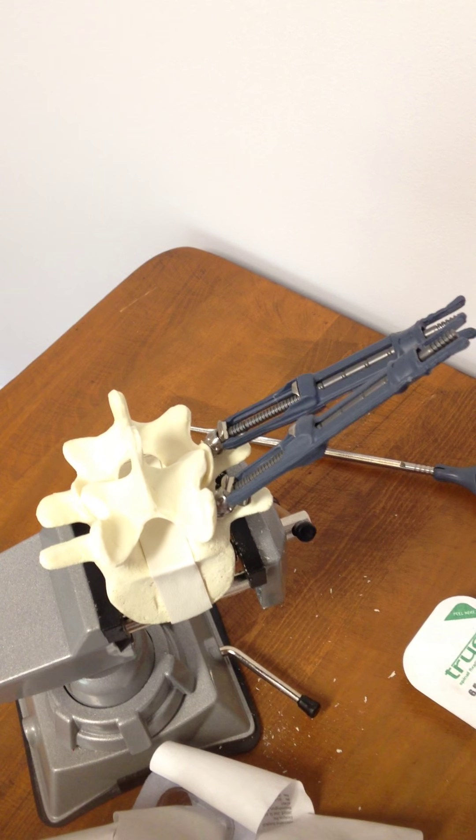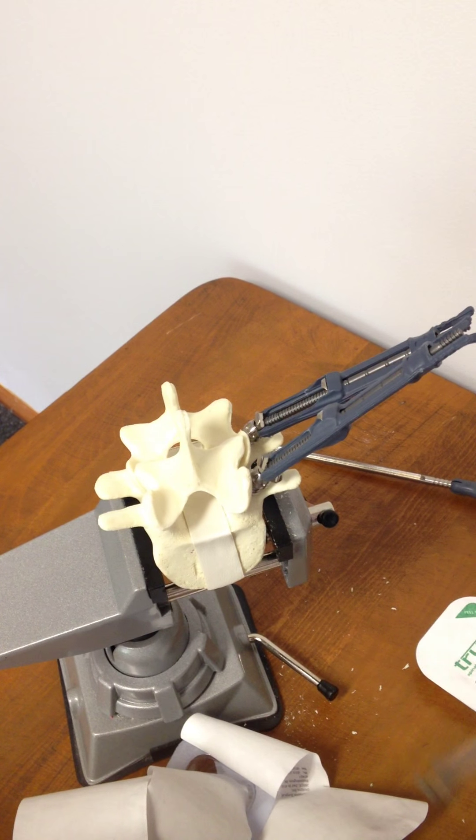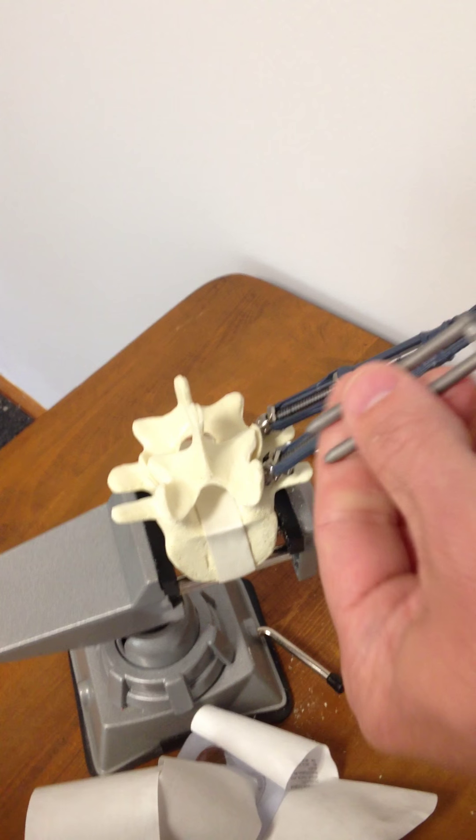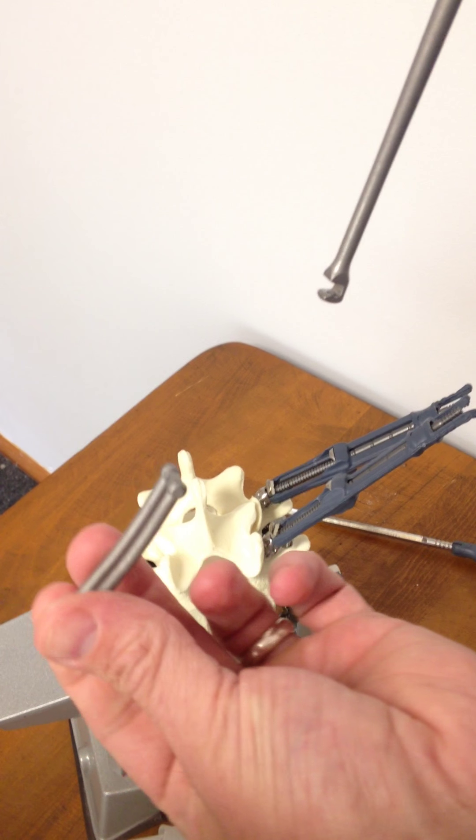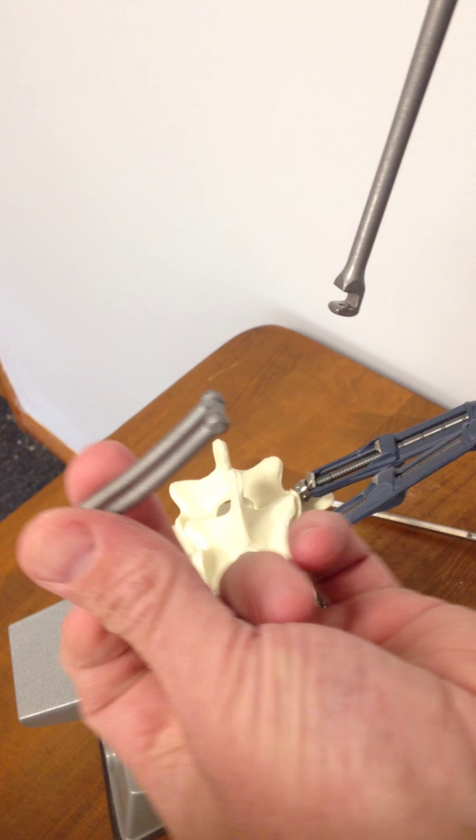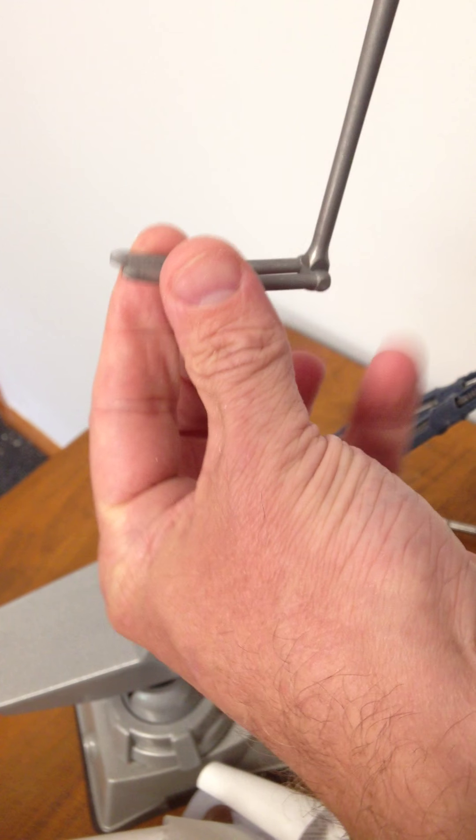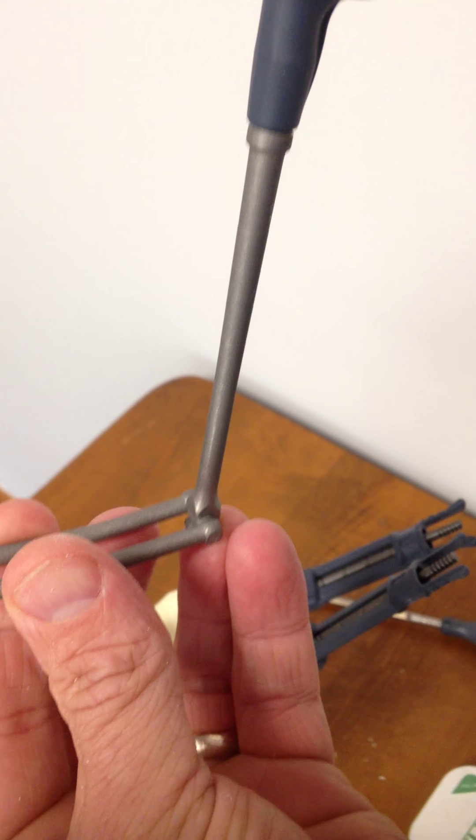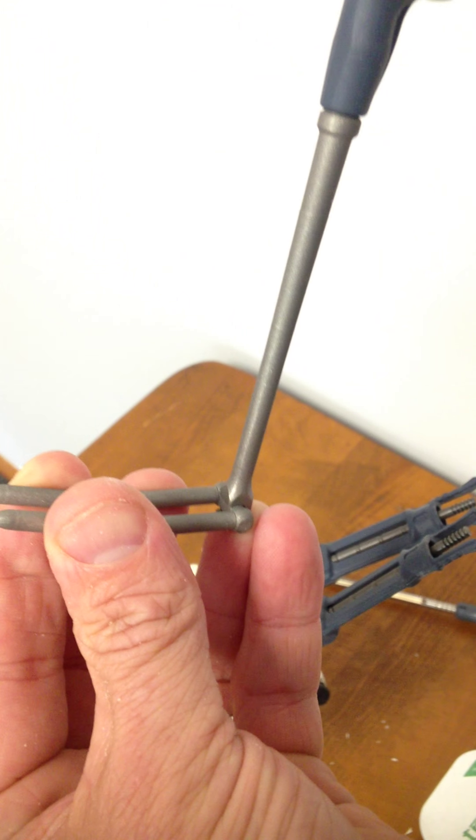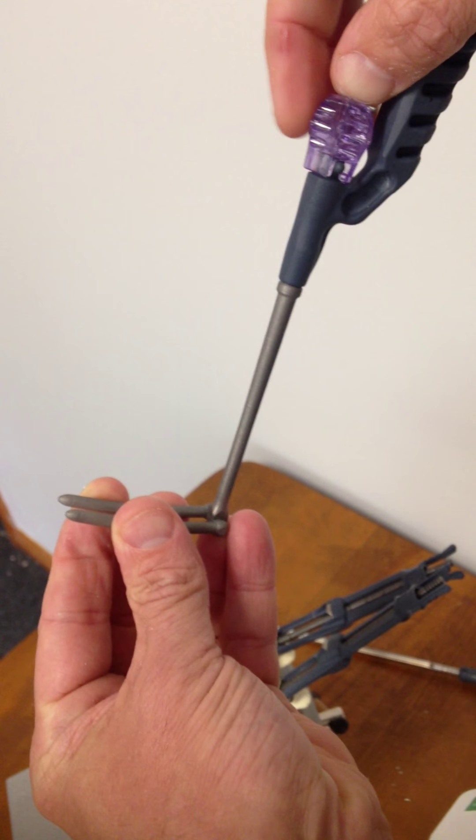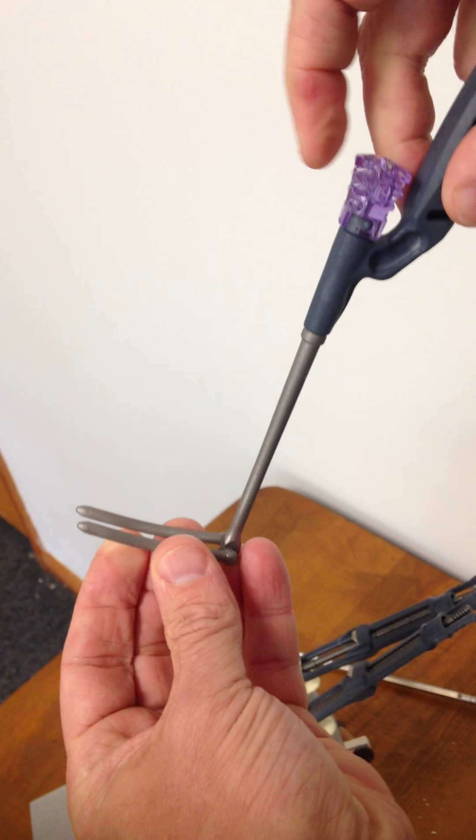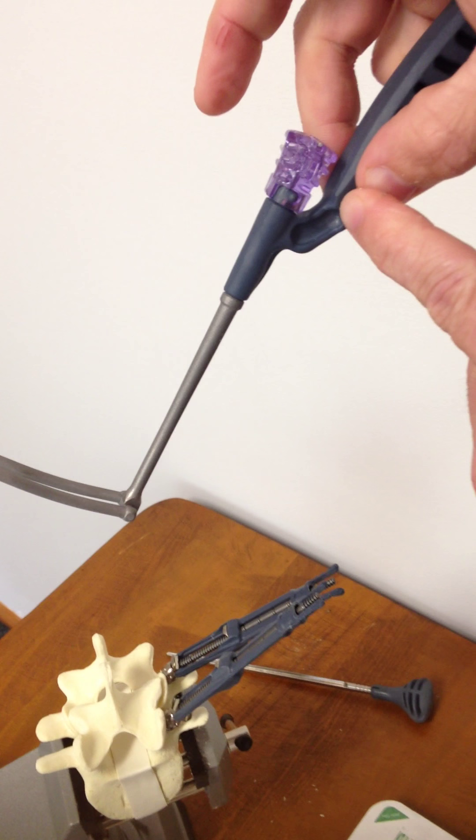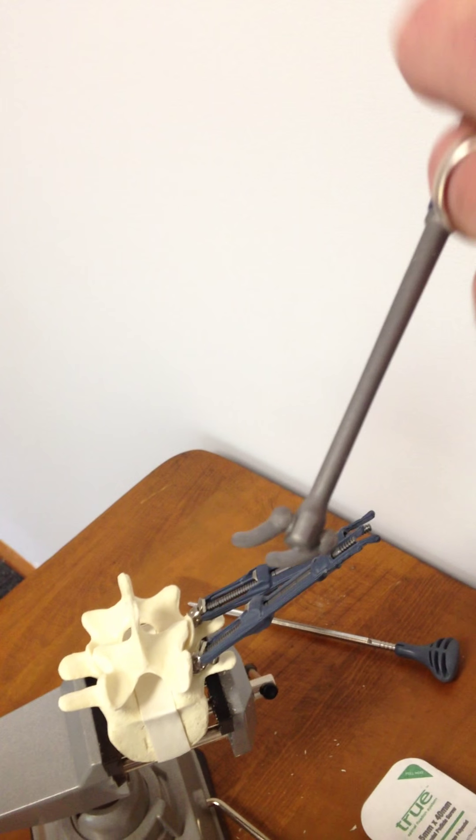And the assembly of our rod to our rod delivery handle, again, is a simple operation. We're going to load that into the handle itself, and then there's a retaining wire that's going to come down and in, and we'll lock that into place with a simple quarter turn.